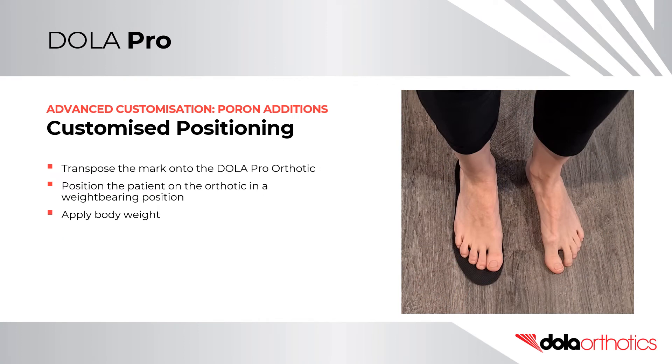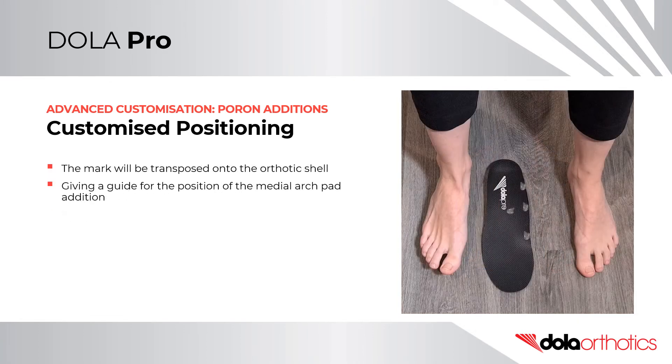To transpose the mark onto the orthotic, position the patient on the orthotic in a weight-bearing position and apply body weight. The mark will now be transposed onto the orthotic shell, giving a guide for the position of the medial arch pad addition.